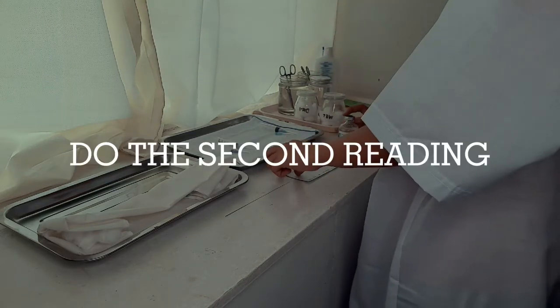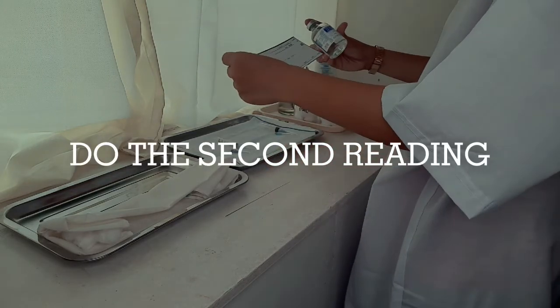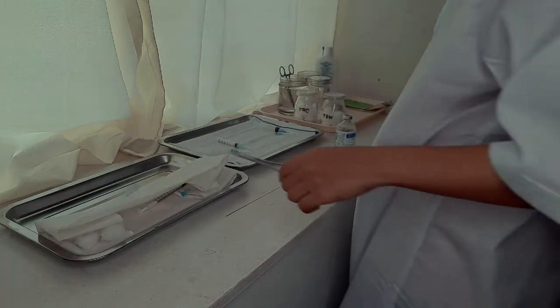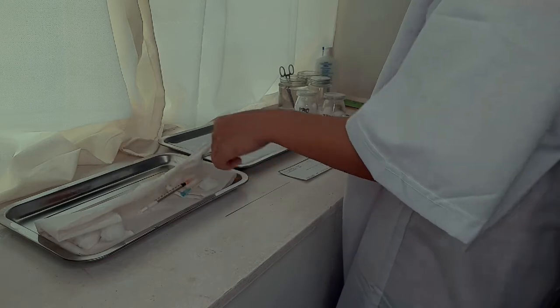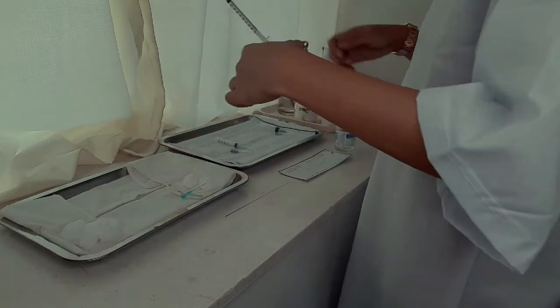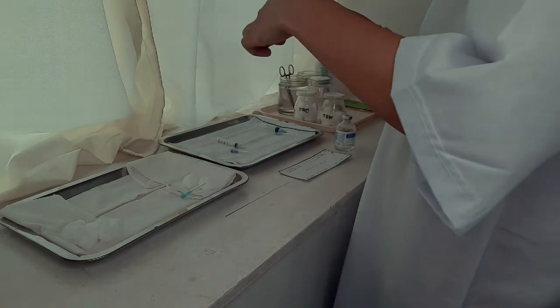And then do the second reading. Sterile water, sterile water. Attach the aspirating needle to the syringe. Aspirate air equal to the amount of the medication you will withdraw from the vial.